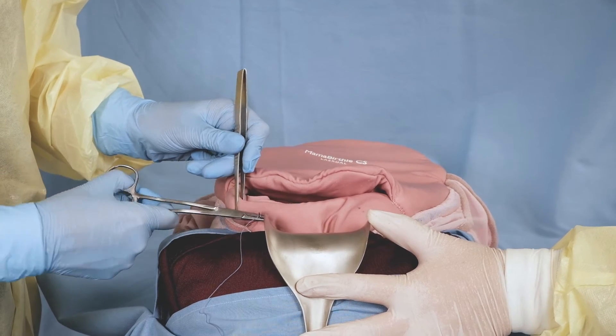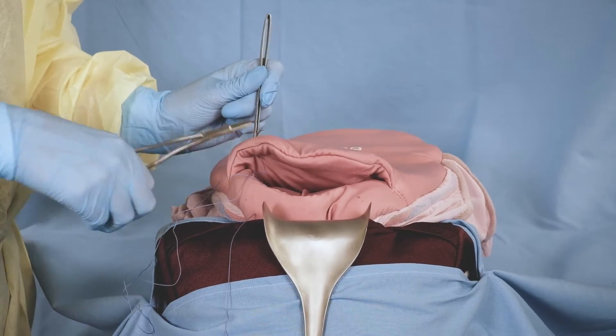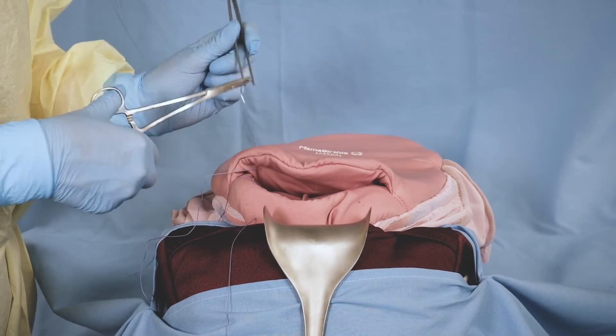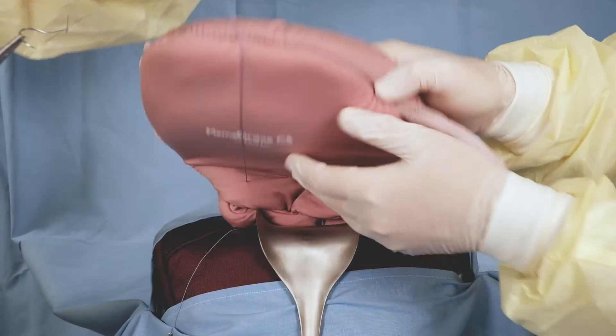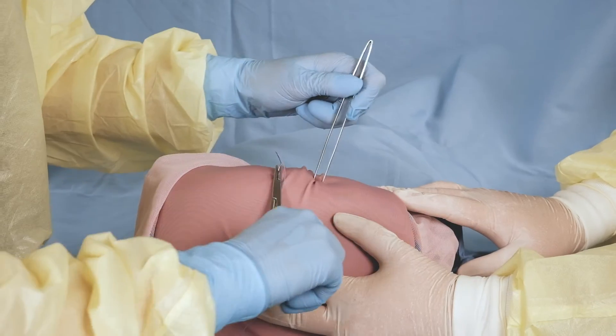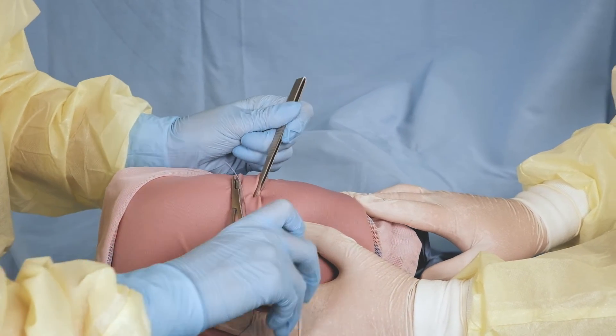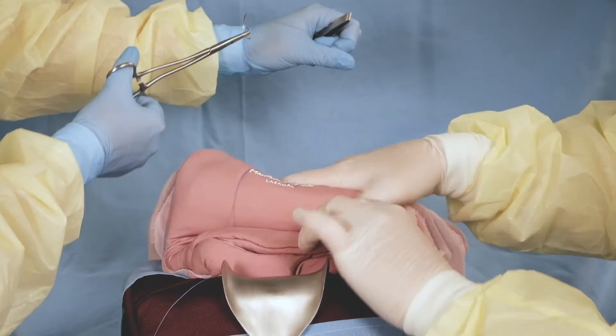Insert the suture 3 cm below the uterine incision and exit 3 cm above the incision. Take the suture over the fundus to the back of the uterus. Insert a horizontal suture in the lower segment. Compress the uterus and tighten the suture.